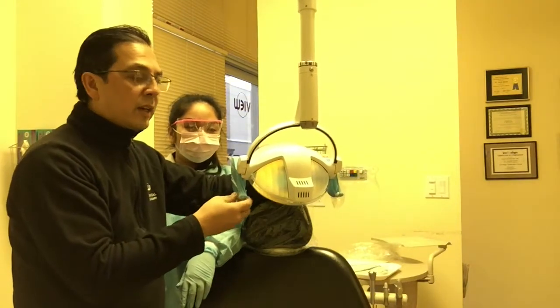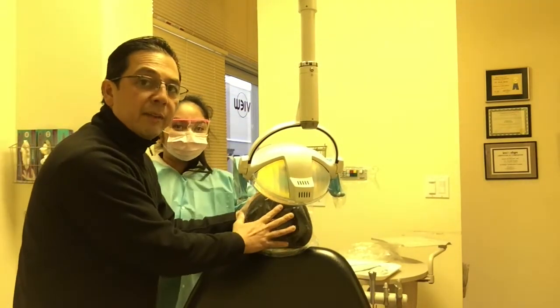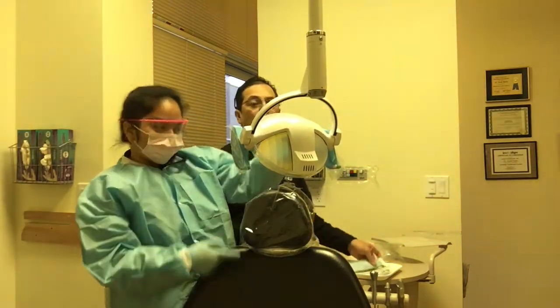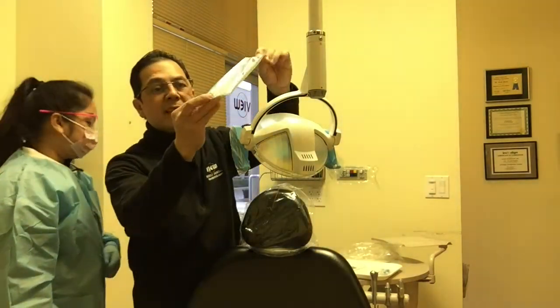So we've got protection for disinfecting on the lights, and we've got it on the headpiece also. And then when a patient comes in, they come in in a bag like this, sterilized.